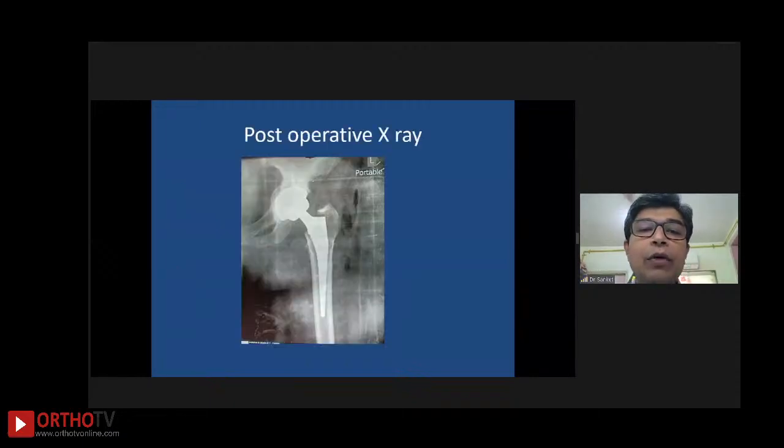So now let me come out with this post-operative X-ray. This is what I did. I did a cementless Pinnacle cup along with a Corail stem, with ceramic on polyethylene articulation.